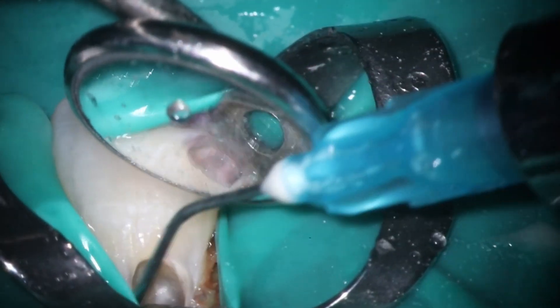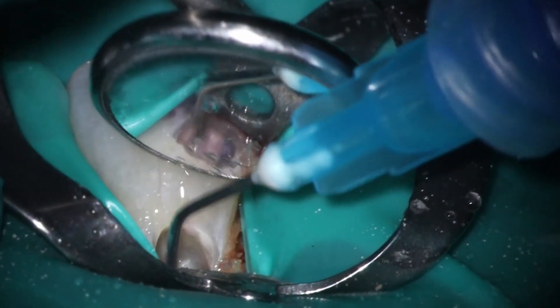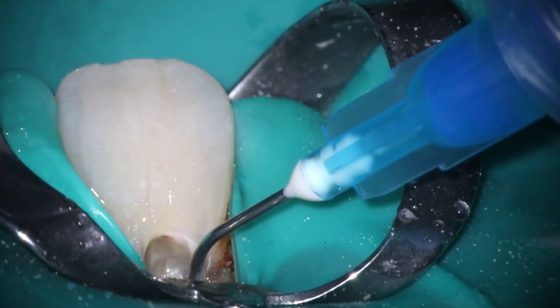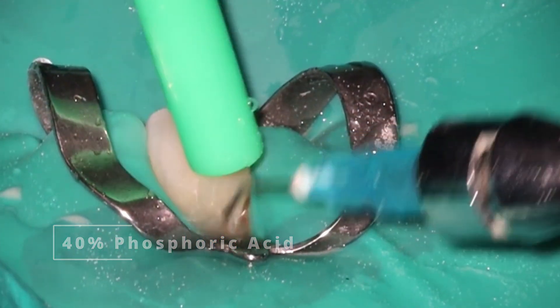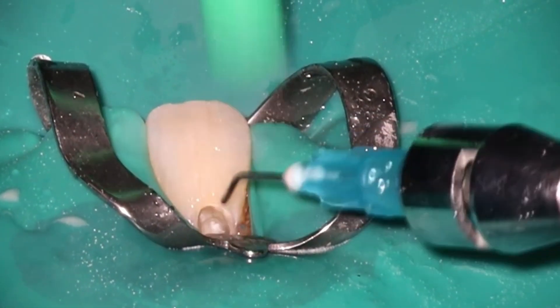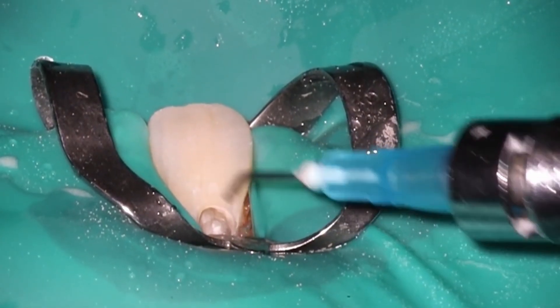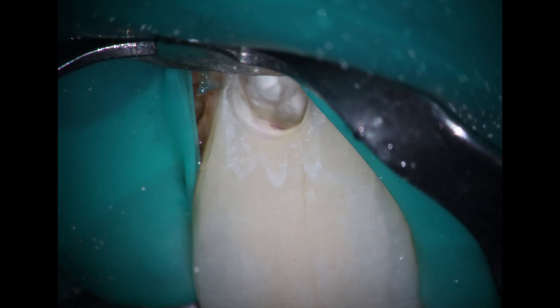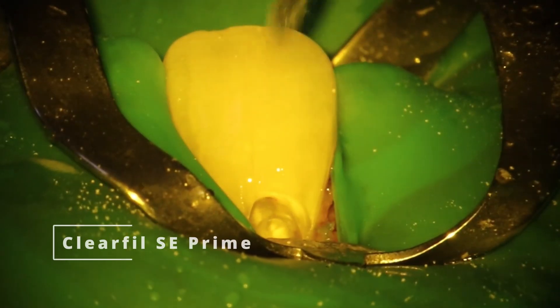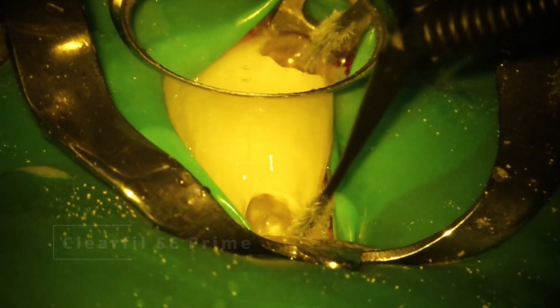Looking down at that area, you can see it looking much, much better down at the apical region. So we're going to start off here with the normal etch like we would for everything. You want to take it up onto the tooth as well — remember, we're going to be bonding. It's going to get thin up there for sure, but we want that transition line looking as clean as possible. And that is what it looks like when it's all cleaned up. You can see those little grooves that I made just to help hide that transition line. Going in now with the same prime and bond that we would use for any case — works great in something like this.